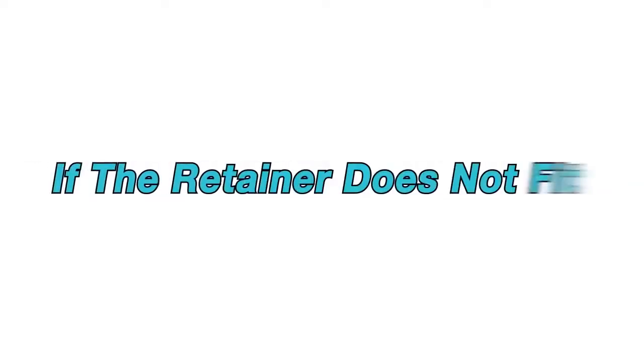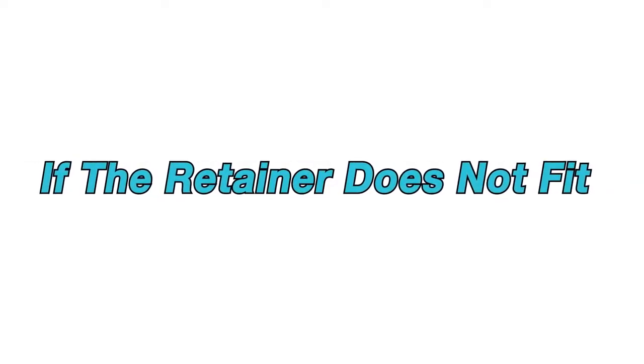If for some reason the Essix retainer is not fitting, please make an appointment for us to check it. Tight and uncomfortable retainers, or retainers that do not fit all the way in, are indications that your teeth are moving. If this is something that you're experiencing, wear your retainer as much as possible and give us a call to make an appointment so that we can check it.